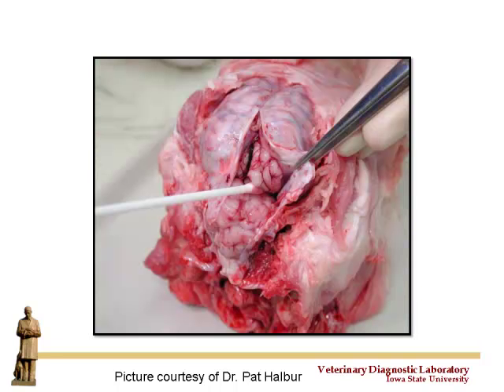And here I'm going to go through a couple of steps to show you how to do this that makes Dr. Rosso's and Dr. Marie's and my job a little bit easier. I do like to mention that you can take CSF fluid prior to or after death. It works well. It's sometimes difficult. A lot of times, if you get a clean sample, it's really good. I'm not going to show that.